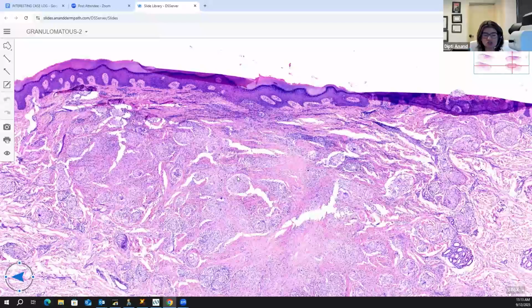Sometimes, in nervousness, you may not be able to figure out where the foreign material is. Then use your general sense and common knowledge. It's a big specimen. It's a sarcoidal process located in the deep dermis. It has areas of fibrosis in it. It has shreds and tears in it. So this has to be a foreign body.